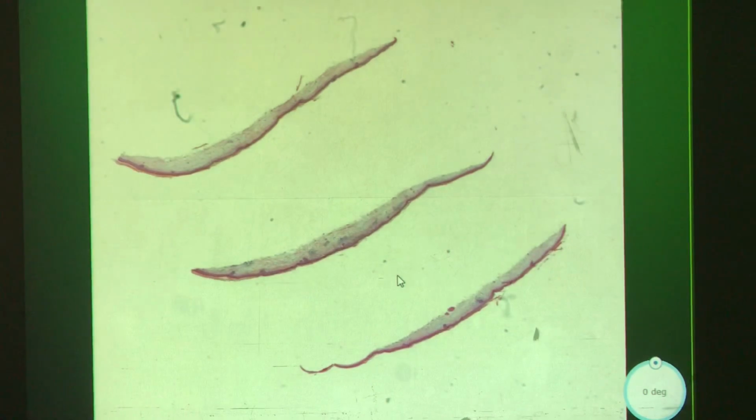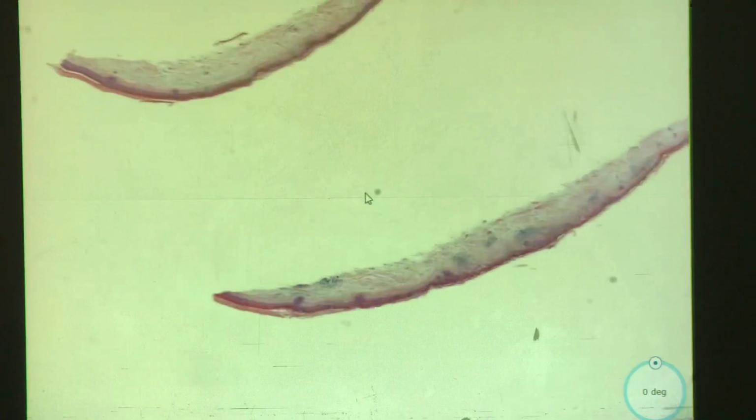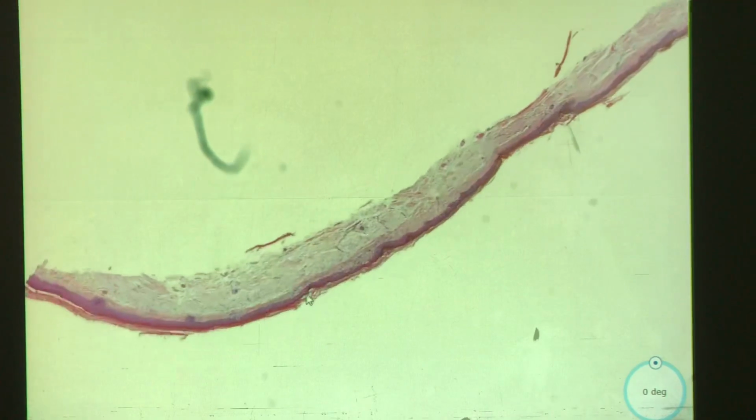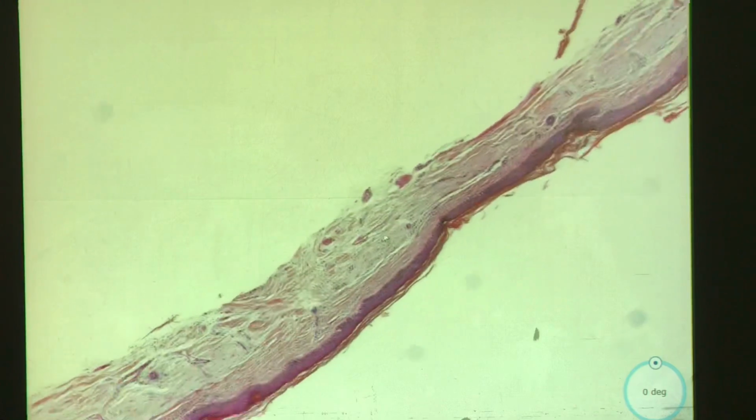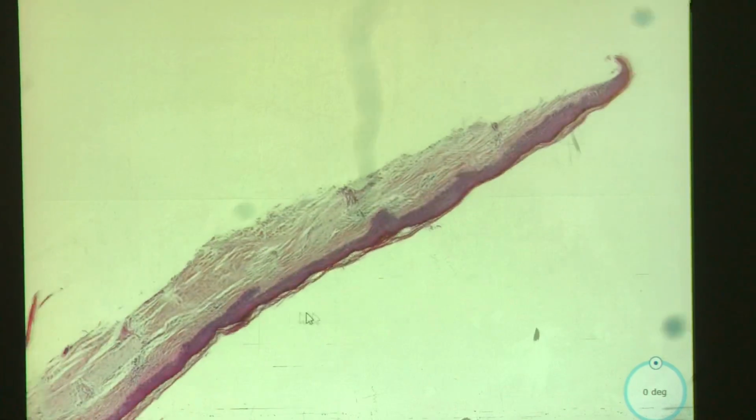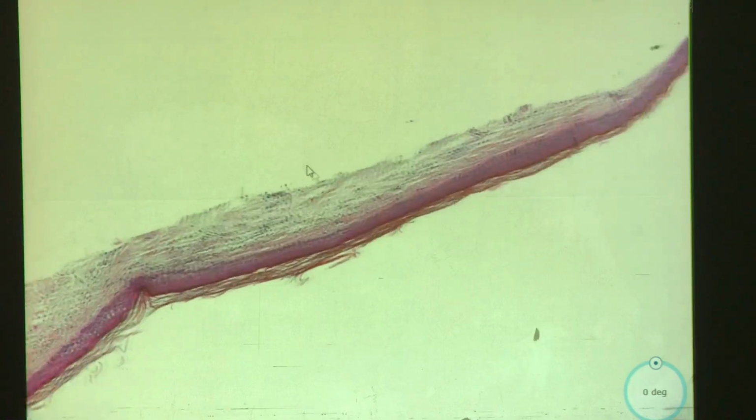Superficial specimen. Yes. Well, people generally don't like chunks of skin being taken out without good reason. With good reason that they don't like it.